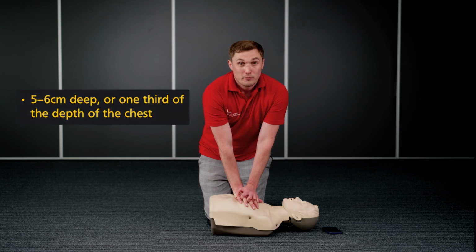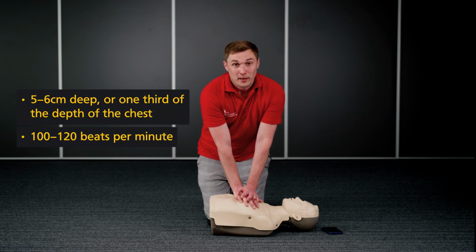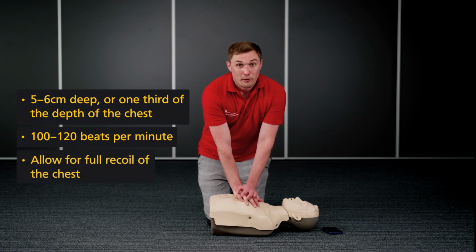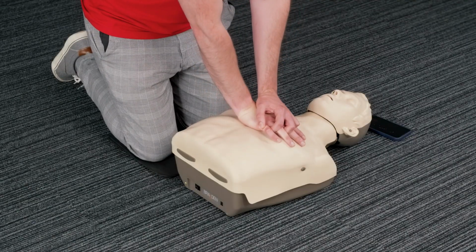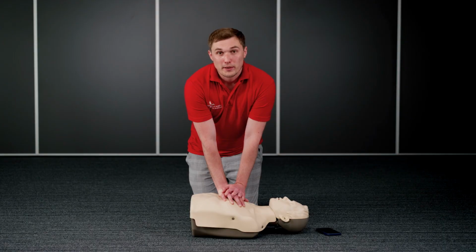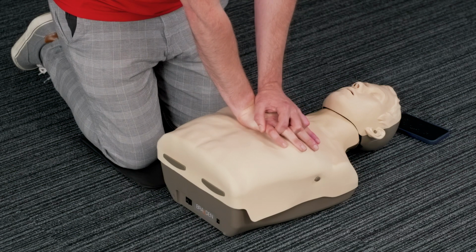I need to be 5 to 6 centimetres or a third of the depth of the chest, going at about 100 to 120 beats per minute, and I need to allow for that full recoil of the chest. So after I come down, I need to allow that chest to fully expand again. Be reassured, the operator will be with you the whole time. They will talk you through the process and they will count you in while you're doing compressions to keep you in time. So doing effective compression should look something like this.